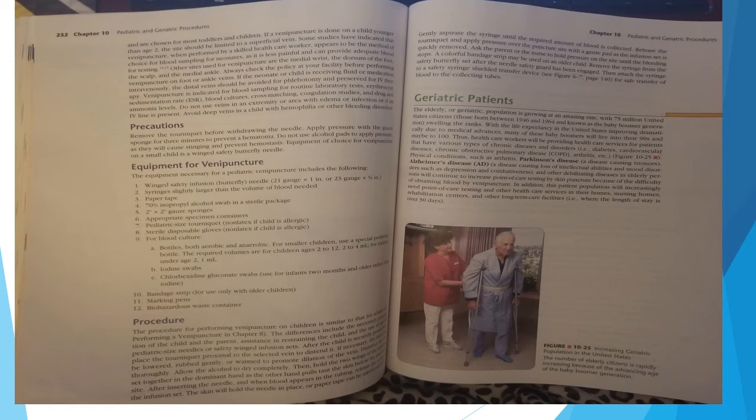Other sites used for venipuncture are the medial wrist, the dorsum of the foot, the scalp, and the medial ankle. Always check the policy at your facility before performing venipuncture on foot and ankle veins. If the neonate or child is receiving fluid or medication intravenously, the distal veins should be avoided for phlebotomy and preserved for IV therapy. Venipuncture is indicated for blood sampling for routine laboratory tests, erythrocyte sedimentation rate, blood cultures, cross-matching, coagulation studies, and drug and ammonia levels.